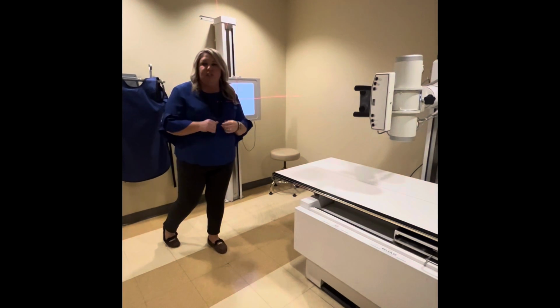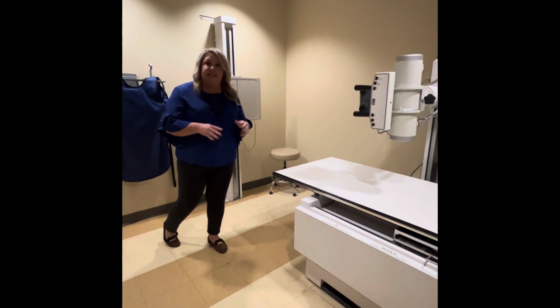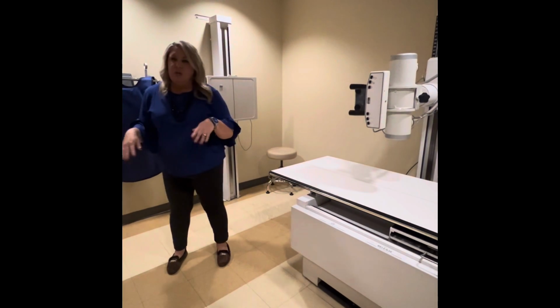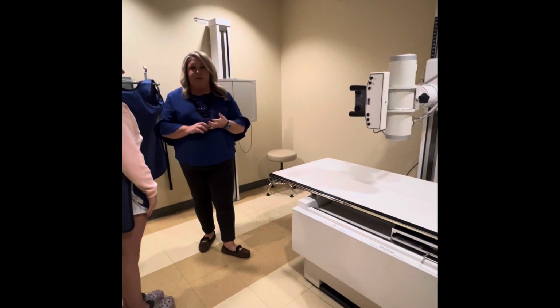On an average patient, we're going to go at this facility 117 kVp with about 4 mAs. So that's all set up and ready to go. So we're good there. As we bring our patient in, we're going to make sure that we do a 2-part verification on ID. So we'll do name and birthday.